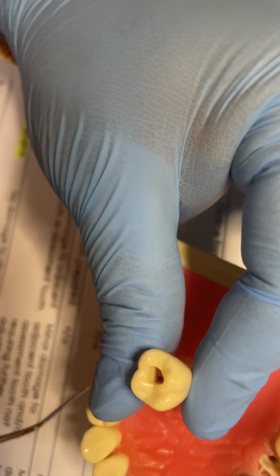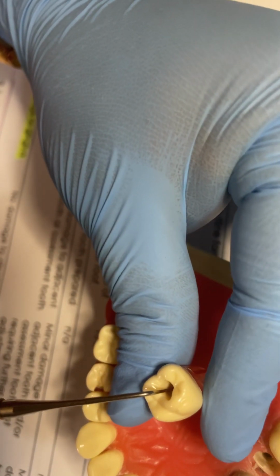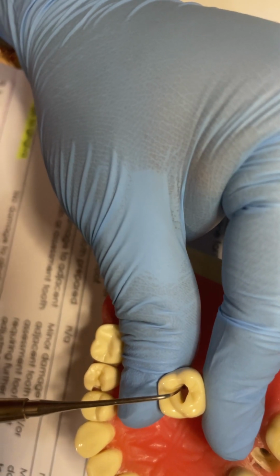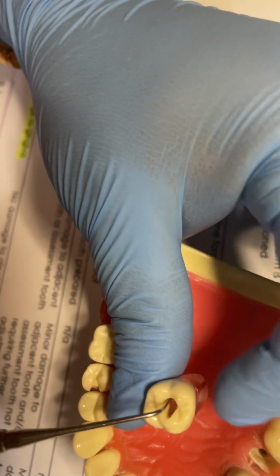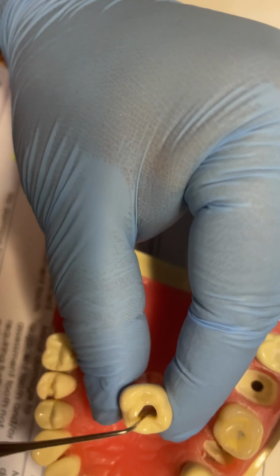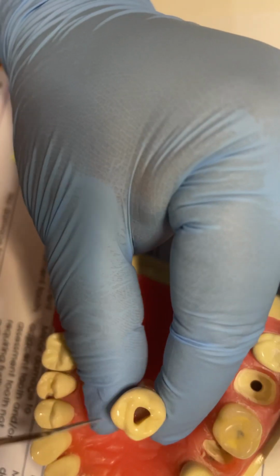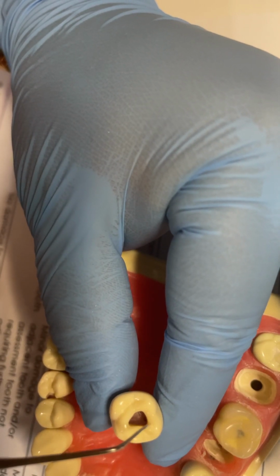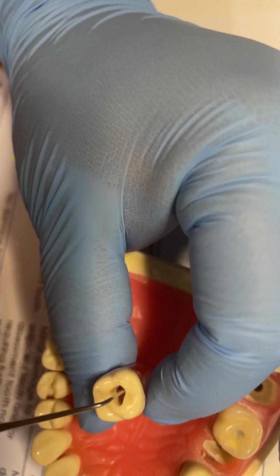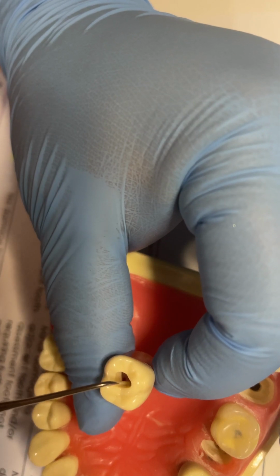So I'll show you now. This is the distal canal, at the central pit. And then this is the mesiobuccal canal, which is halfway. So this is the ridge, see, it's halfway gone. So it's here. And then see this palatal cusp tip, it's just here.